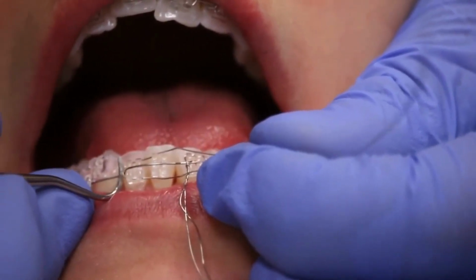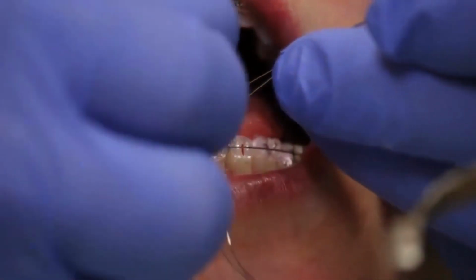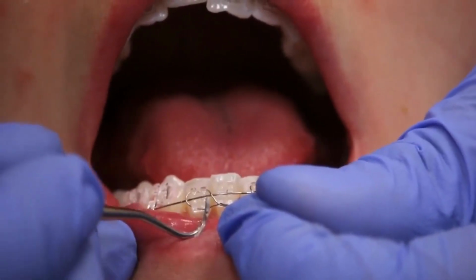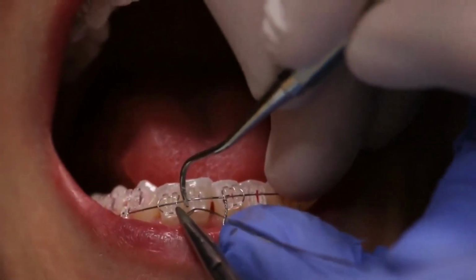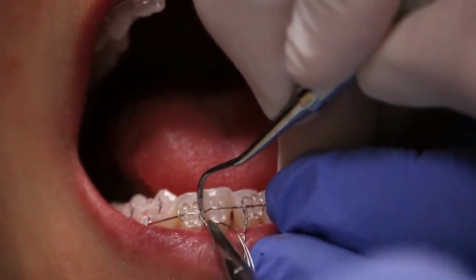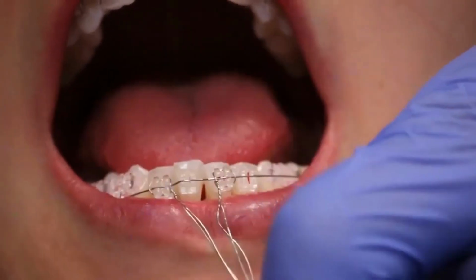Notice how I use my sickle to push the ligature tie very tight against the bracket, so I don't have any slack. Now we just pass our ligature tie and start twisting. I'm doing this left-handed so they can see, but I can't because I don't want to break the brackets. Open up a tiny bit for me. You can have your assistant push on the wire, push hard, to get full engagement. This is a very light wire, and then your tie is complete, and hopefully you can notice the deflection of that arch wire.